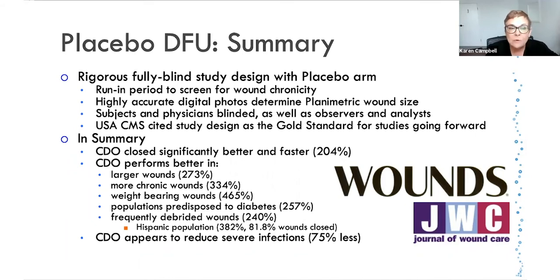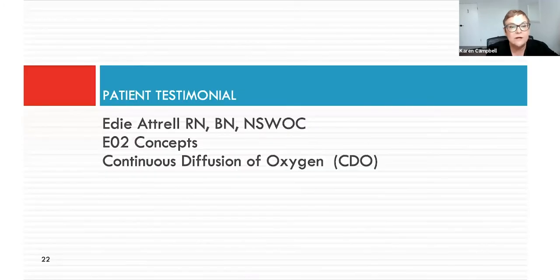And the other thing that we found in the CDO arm is that there were 75% less severe infection. So that's a very important result for patients with diabetes.